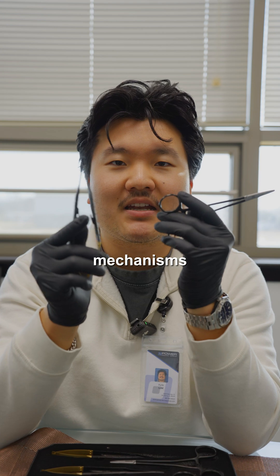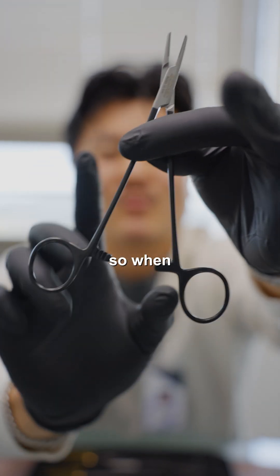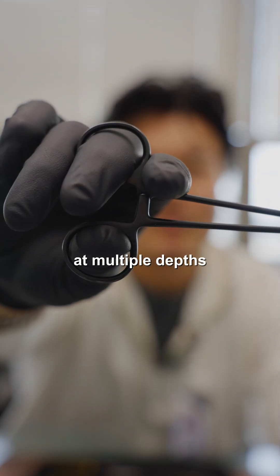With utilization, the locking mechanisms are a little bit different. With the needle driver, the locking mechanism is on the bottom here — it's a ridge locking system. So when you close it, it locks in place at multiple depths.